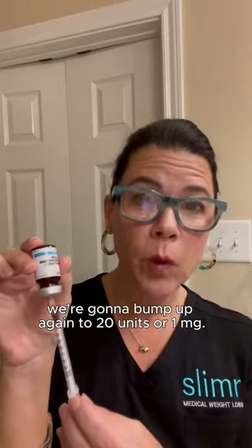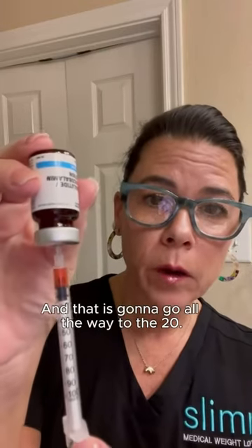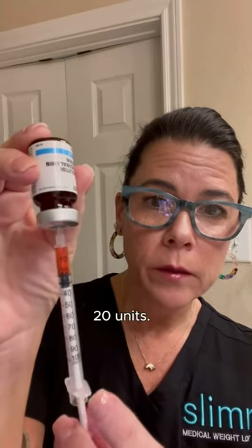Now we're going to bump up again to 20 units, or one milligram. That is going to go all the way down to the 20 — 20 units.